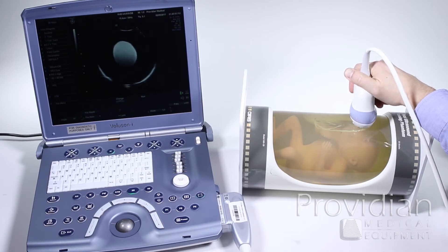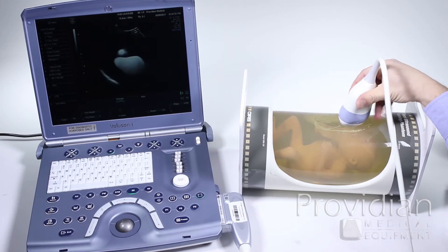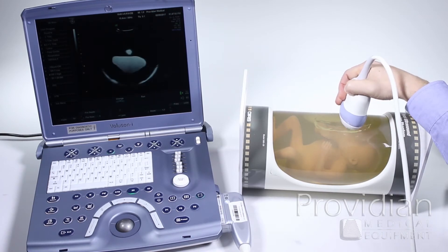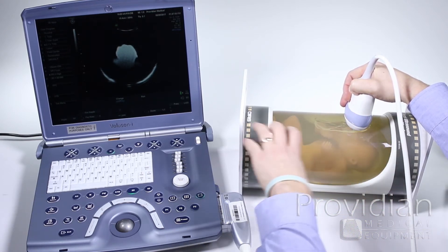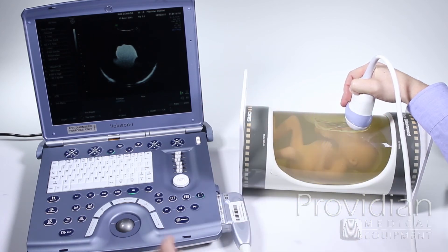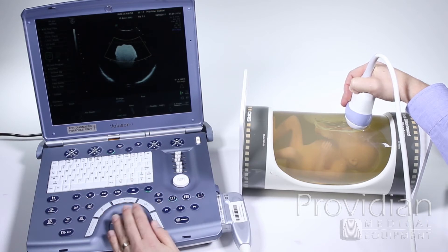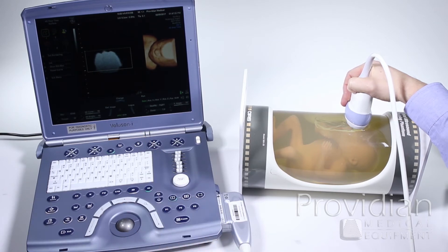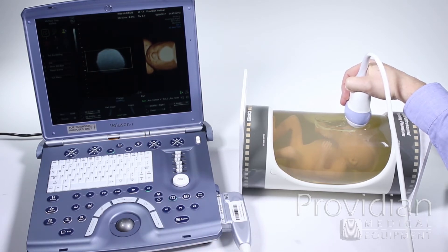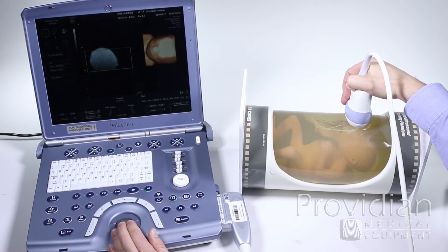The difference between 2D and 4D is that 4D is like taking an entire loaf of bread. So instead of just taking a slice of the baby, it will sweep back and forth and show me the surface of that loaf of bread. When we go into 4D, on the left it's showing me the slice that it's looking at, and on the right it's showing me the full surface rendering of that baby.